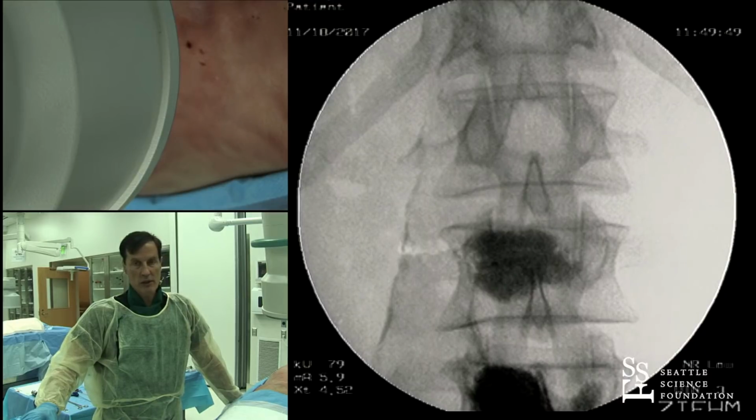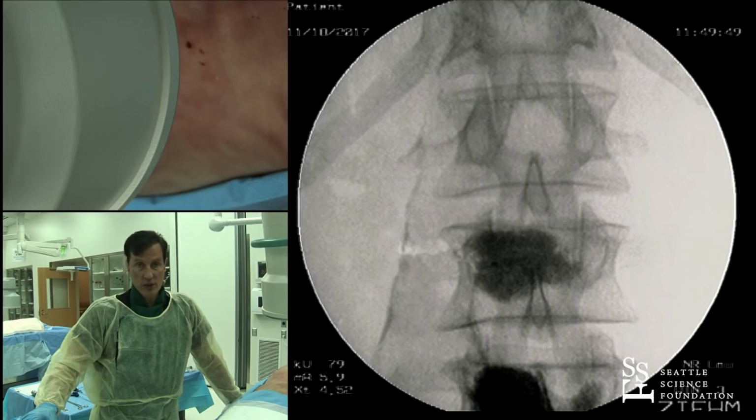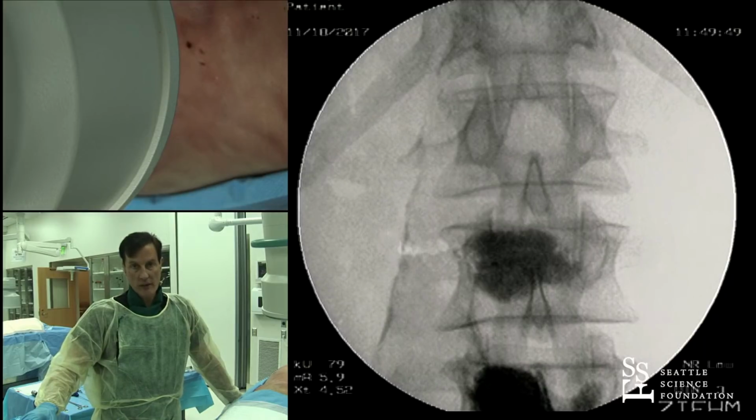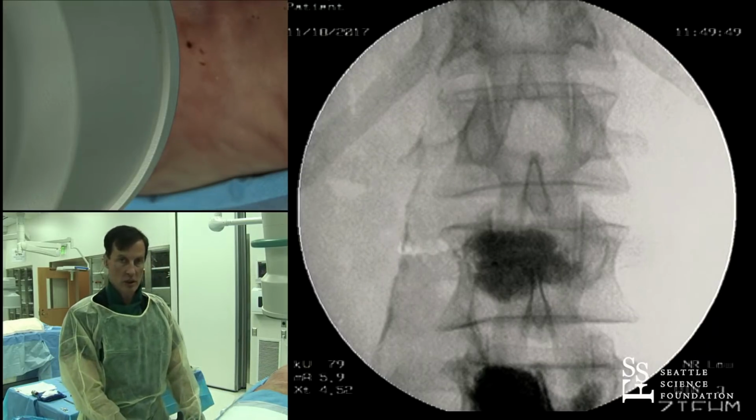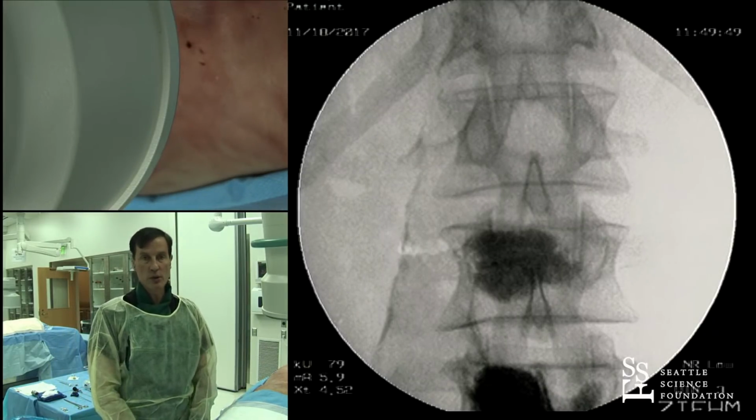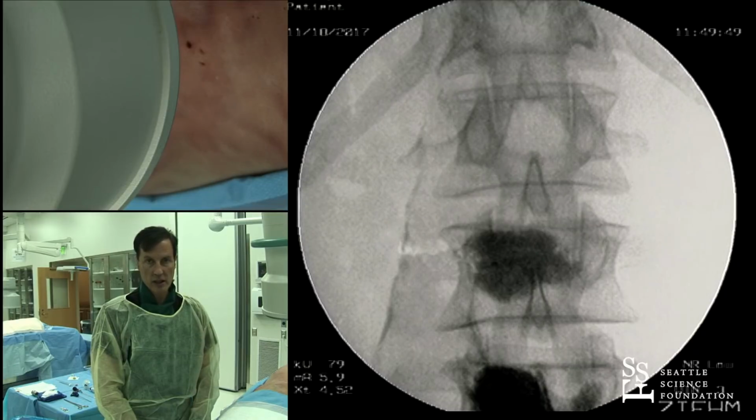But again, extravasation around the paraspinal region and even into the disc is usually incidental. In the Beall trial, we had a 21.4% extravasation rate. The symptomatic extravasation rate was 0. And the vast majority of it, 80%, went paraspinal and into the disc.